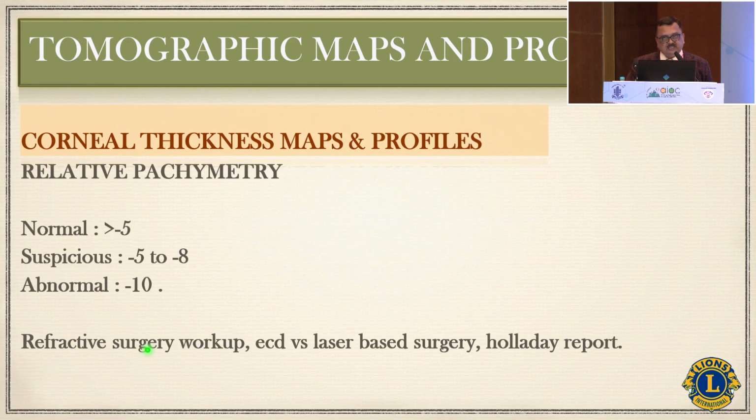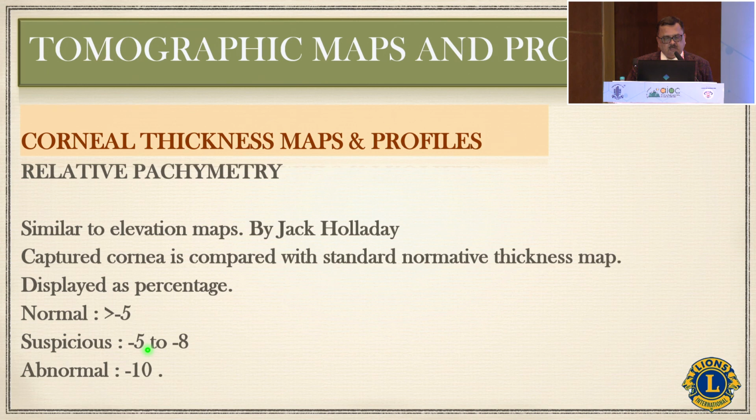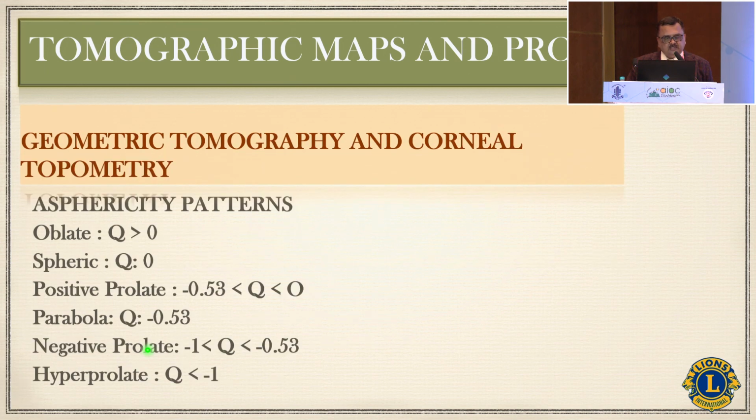Relative pachymetry is just like elevation maps. It was devised by Holladay. Asphericity, we all know.